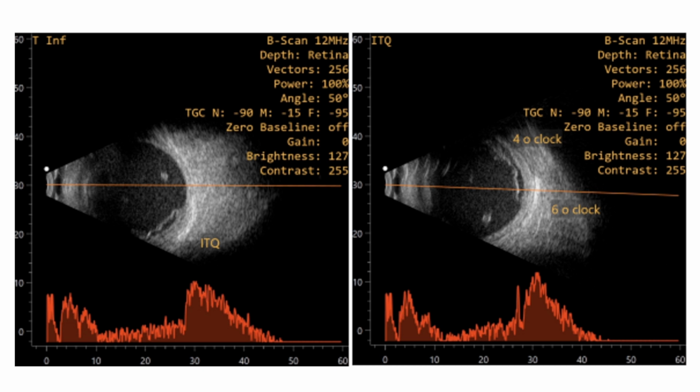Another thing. Why was the ultrasound repeated post-operatively on day 2? The fundus view was clearing only in the center, and I wanted to image that subretinal abscess area. So eventually he developed RD there, and that subretinal abscess exactly gave way.